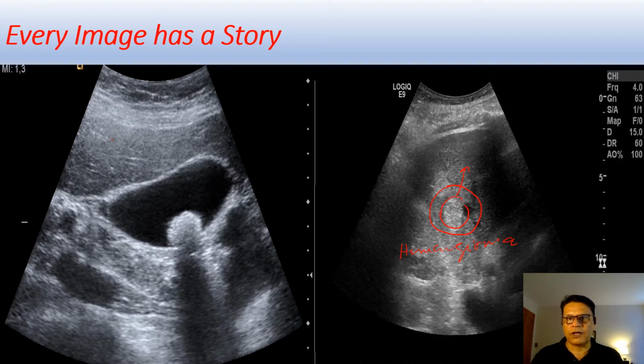Here the echoes have unloaded a lot of information and try to tell us that this area is more solid as compared to this one. In this image, this area shows high concentration of echo, showing that this area is brighter than the surrounding area, more solid than the surrounding area.